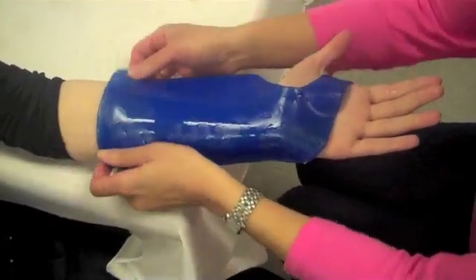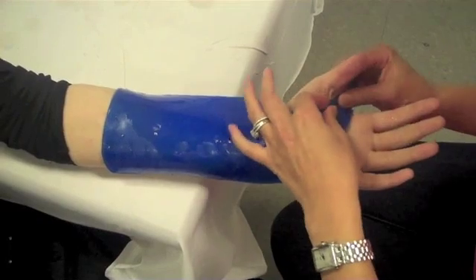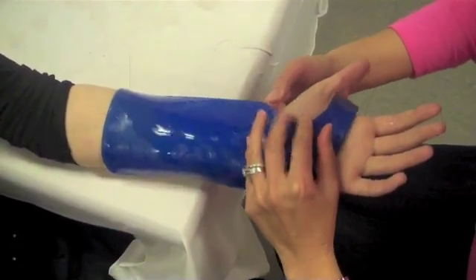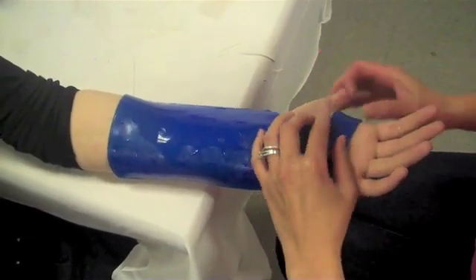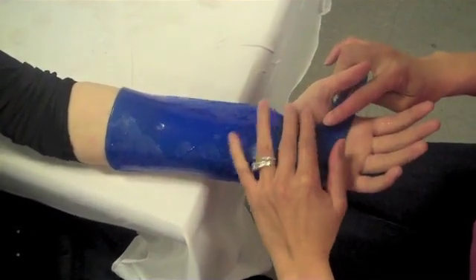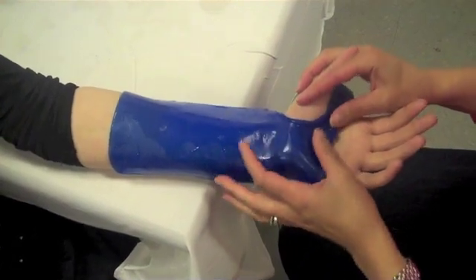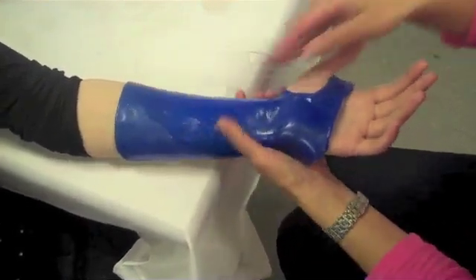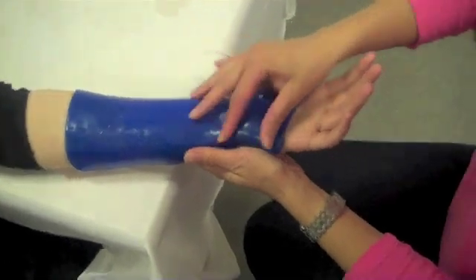After the pattern has been traced onto the material and the material has been cut out and heated, place it on the volar aspect of the patient's hand and forearm. Roll the aquaplast at the patient's thenar eminence, then roll it by the distal palm or crease. Mold the aquaplast onto the patient's forearm, holding it down for several minutes, allowing the splint to set.